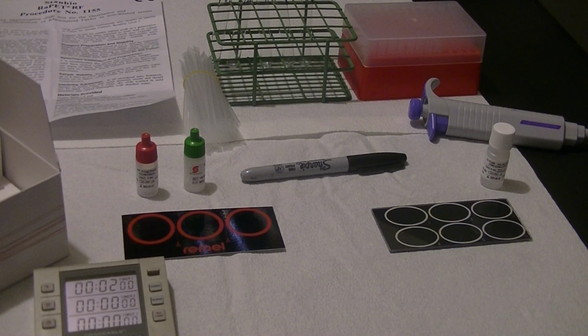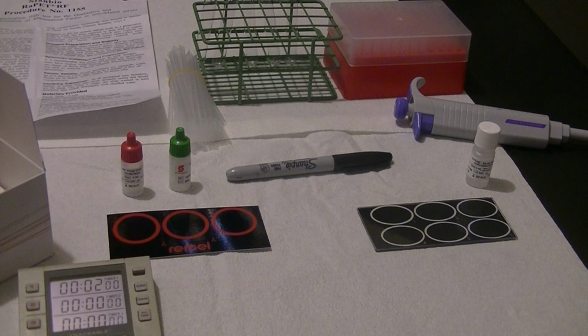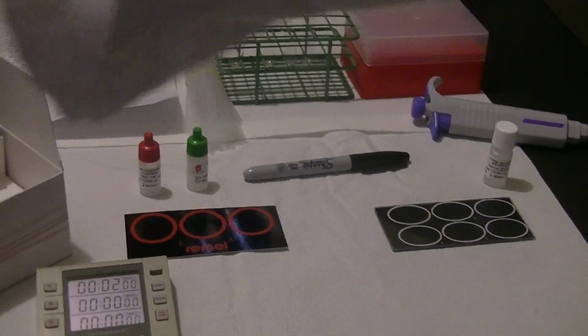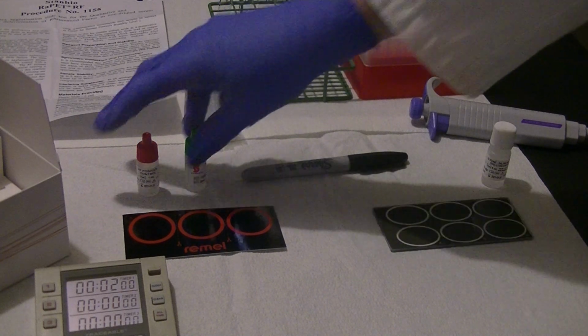Another test we're going to do in lab today is a passive agglutination test, and this one is testing for rheumatoid factor, or RF factor. So in this test, what we're going to be doing is testing a positive control, a negative control, and a patient sample.